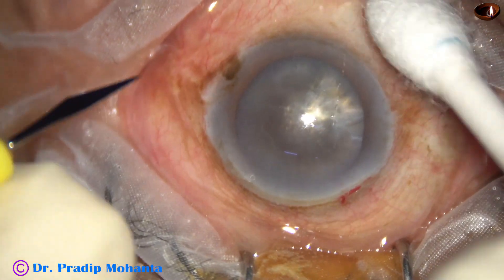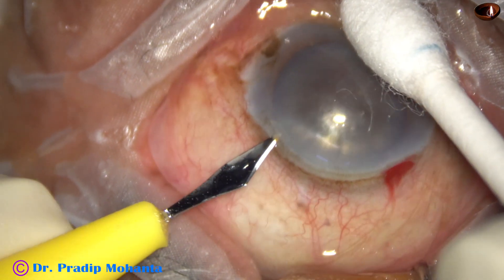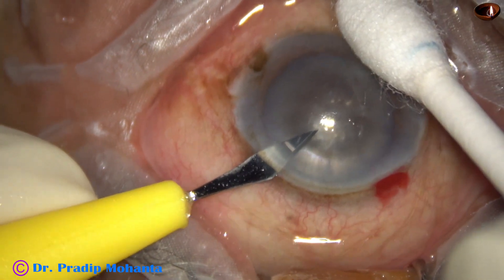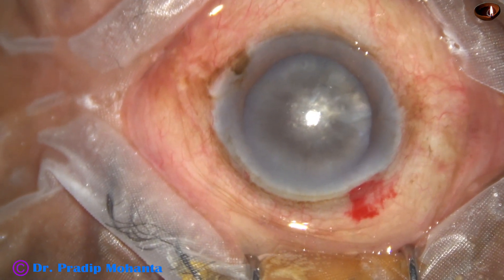So, here I go. I have made the main incision on the posterior aspect of the limbus at around 11 o'clock, and on the left side of the main incision, 3 clock-hours away, I make a side port.